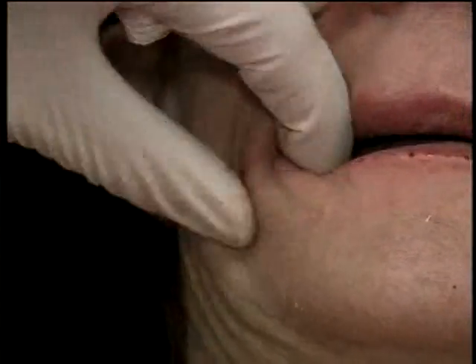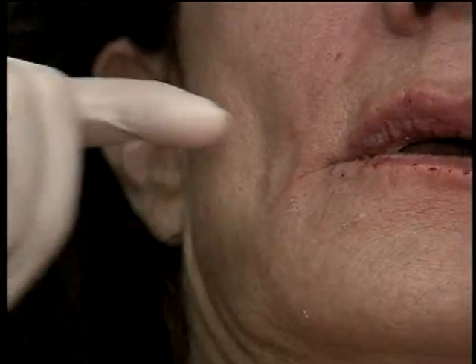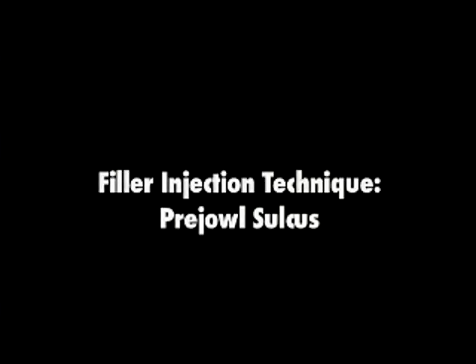Okay, I can take my hand here, massage it. And you can appreciate how that corner of that mouth comes up.